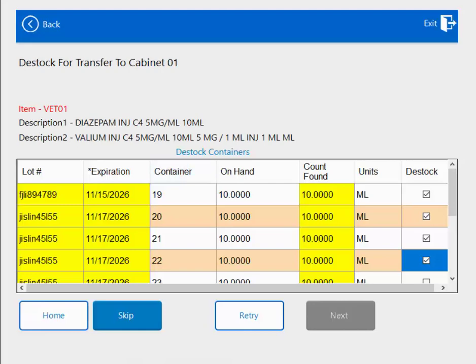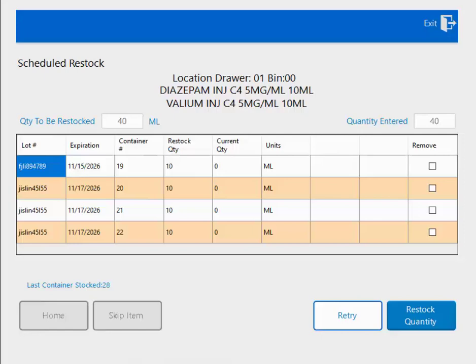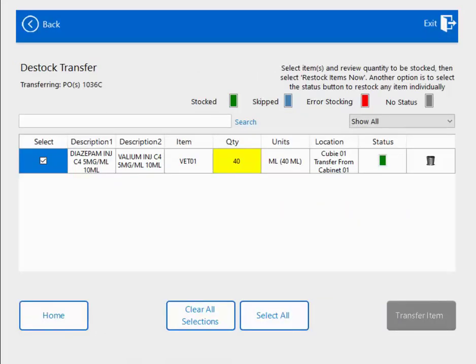I've removed those four bottles. I confirm that the numbers on the four bottles in my hand match containers 19 through 22. Once I've removed the bottles, I shut the matrix drawer and hit next. It is diazepam, so I have witness turned on. The four bottles removed from backstock have now been put into active stock. I've already entered the container, lot number, expiration date, etc. I put the bottles into the Qubex, close the lid, close the drawer, and hit restock quantity. Now I'm taken back to my confirmation screen showing that I did in fact replenish 40 mils of diazepam into my active stock from backstock.